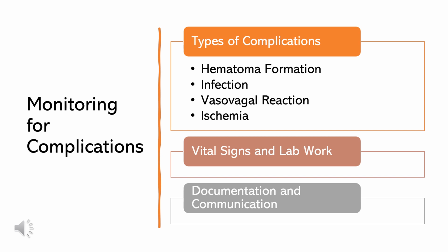Keep a close eye on vital signs, particularly blood pressure and pulse oximetry, to catch any changes that may indicate a complication. If available, review the ABG results as soon as they come in for any abnormalities that may necessitate clinical intervention. Although you didn't draw the sample, your understanding of the values will help to guide future care. Document any signs of complications, interventions performed, and changes in patient status in a detailed manner.